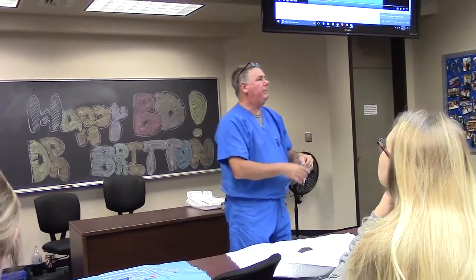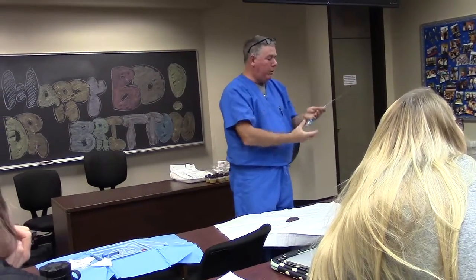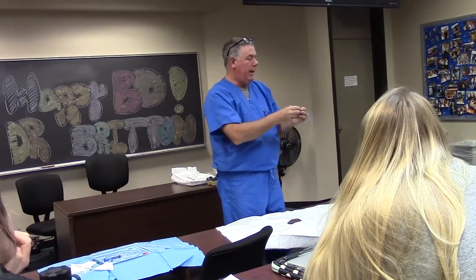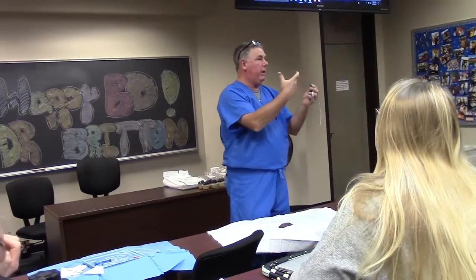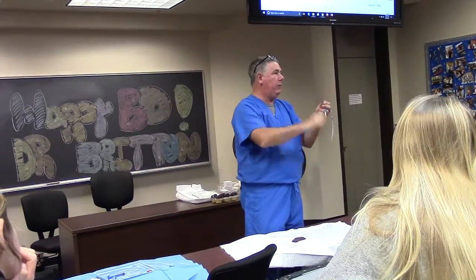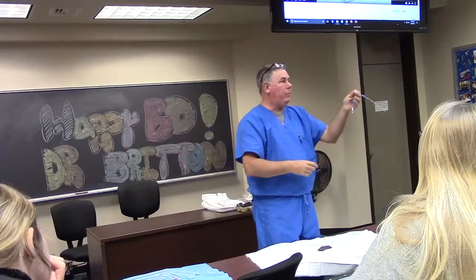I appreciate it, Brandon. If you're flushing the 3 catheter ports with saline, is that something that you do while it's all still sterile? Is that something that your partners do? No, do this while it's still sterile. Take the cap off. Don't let it hit the floor. Put the saline in here until it drips. Put the cap back on, come to the next one, so that all 3 ports are full.